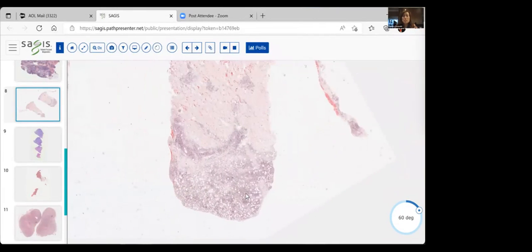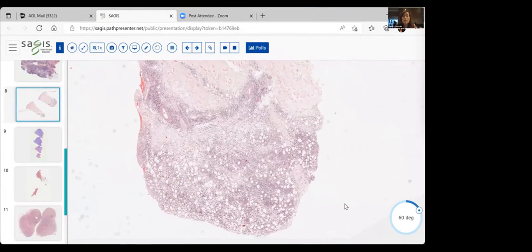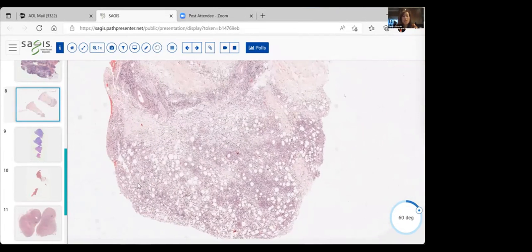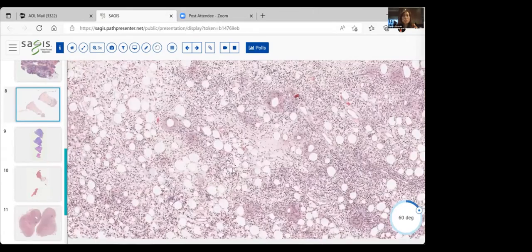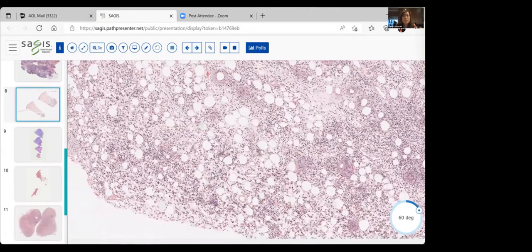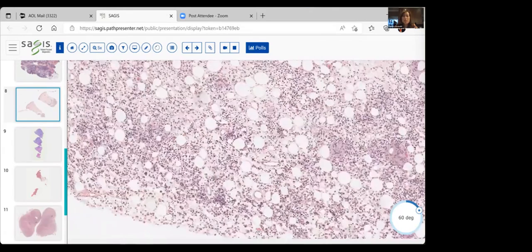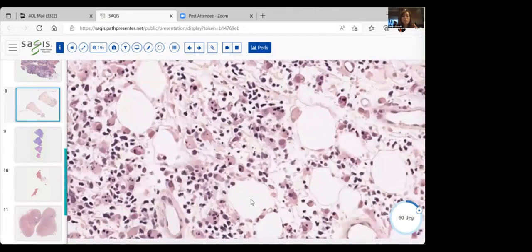This patient could have presented, let's say, on the lower legs with nodules, painful nodules, and draining nodules, and so you would want to, of course, biopsy this. Now, from afar, it looks like this is truly infiltrating the fat. There's a combination of single or mononucleated cells, but then there's also some very strange large cells. So let's see if we can look at some of the large cells in the specimen. And yes, I'm going to go very high magnification to try and show you what's happening here.